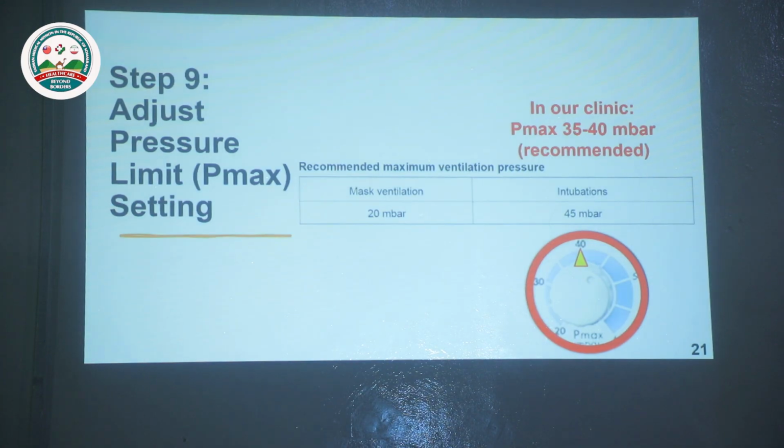Okay, and also I saw the people here are slim, so we don't need to use high pressure. We just need to use 35 to 40, which should be enough for the patient.